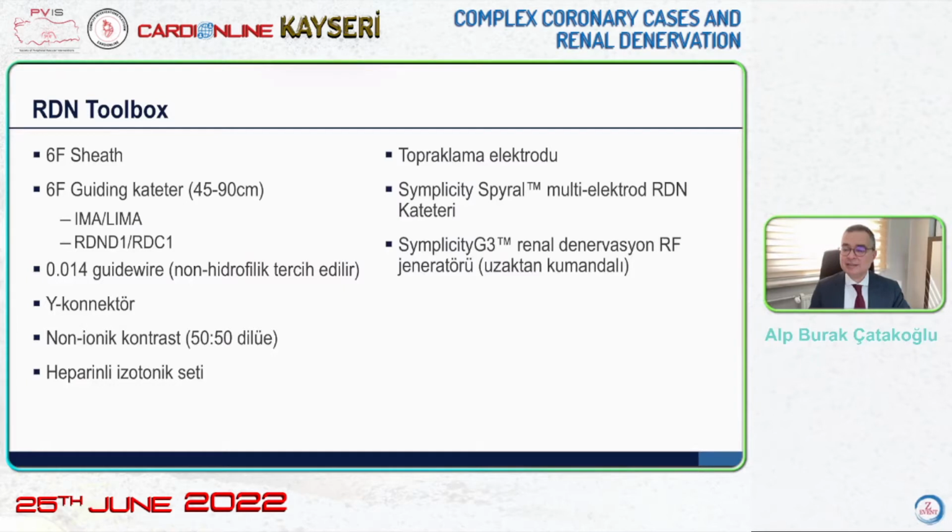There are side effects, or the patient doesn't want to take the drugs. When we say hypertension, we think we can solve everything with medication, but compliance to the drug is very low, and we observe this. Most of the drugs that we recommend to patients are not taken. RDN is a very good alternative in this regard. And the new position papers, as will be explained, describe this as an alternative, supportive treatment for the patient. This is on our agenda.